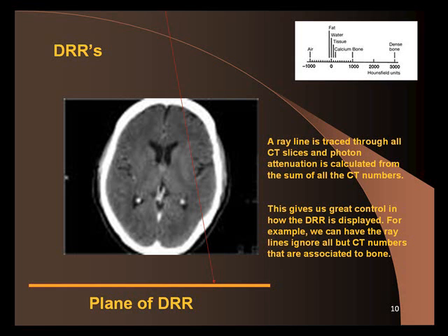Okay, so the computer knows, and if I turn this around, it would look like that. So imagine one of these, but they're all stacked up like this. Okay? So this is a brain with all the slices. Now we don't want to bring the patient to the X-ray room and take an X-ray, because we still need a radiograph to compare the port images, and I'll explain that in a minute. But we don't want to take the patient to the X-ray room, so we can use all the information that we require in the CT scan to create a radiograph electronically.